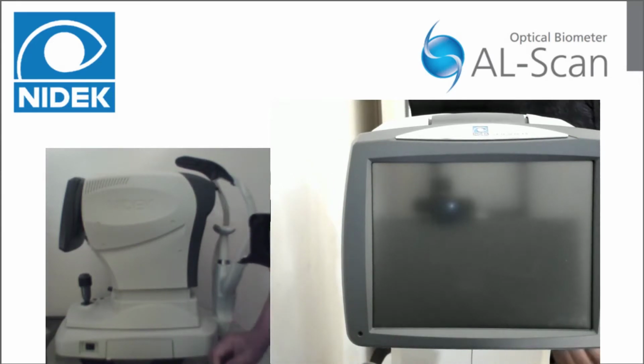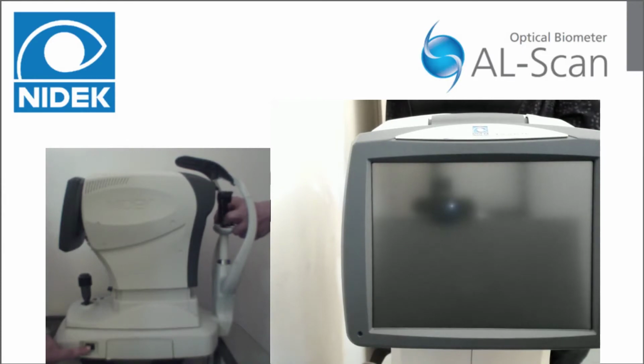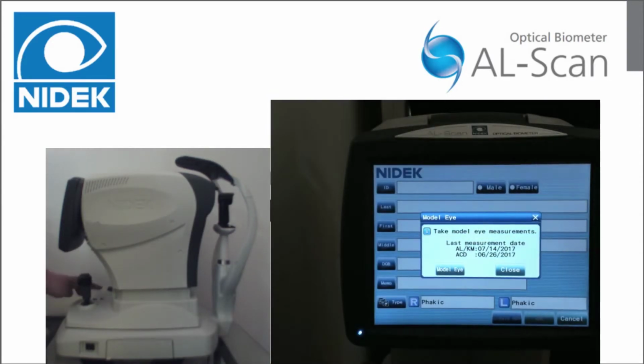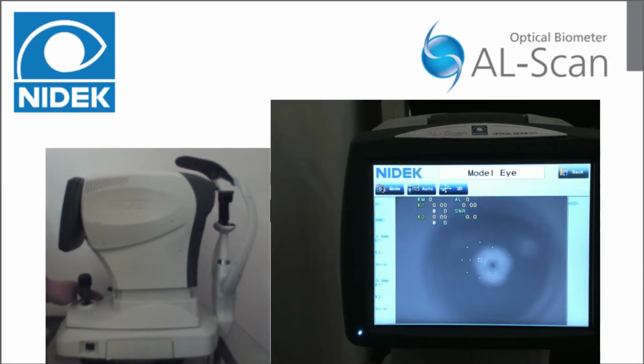First, pull out the two fixing pins from the chin rest. Remove the cap from the AL Model Eye. Place the Model Eye on the chin rest with its lens towards the measuring window. Then insert the fixing pins. Turn on the power switch of the device. Adjust the height of the chin rest with the chin rest up and down button until the lens of the Model Eye aligns with the eye level marker on the forehead rest.